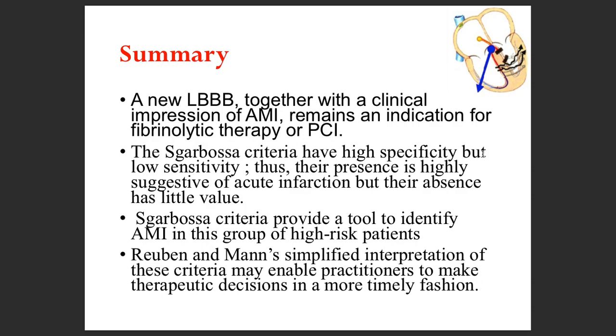But the best thing is, of course, going through the R-wave pattern. Though there are some shortcuts as well. Till the time you get those scientific fundamentals completely in your mind, you can use those tips and tricks as a memory aid. That's what I would always advise.